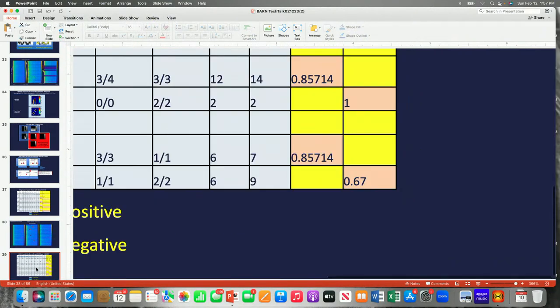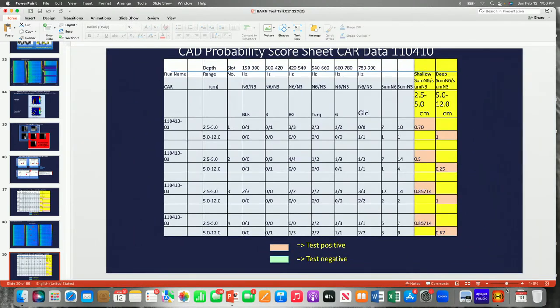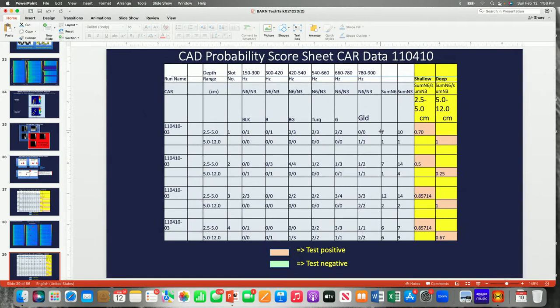Okay. So we take all that information. I'm not going to tell you how we do it. But we can measure the strength of all those points, and we tabulate them across frequency and each of those 4 time slots that I talked about, if you remember. And we give a score to each one of those for a shallow event or a deep event.